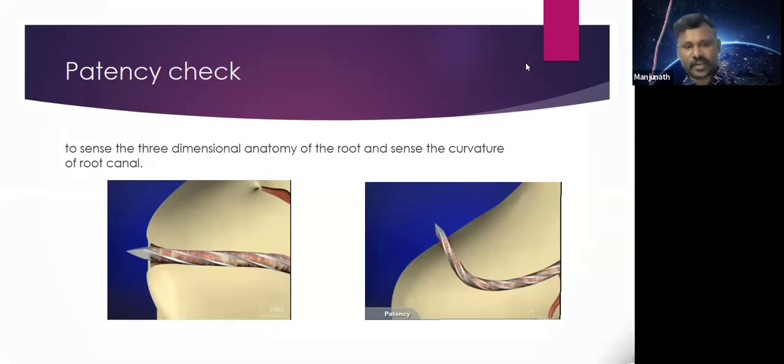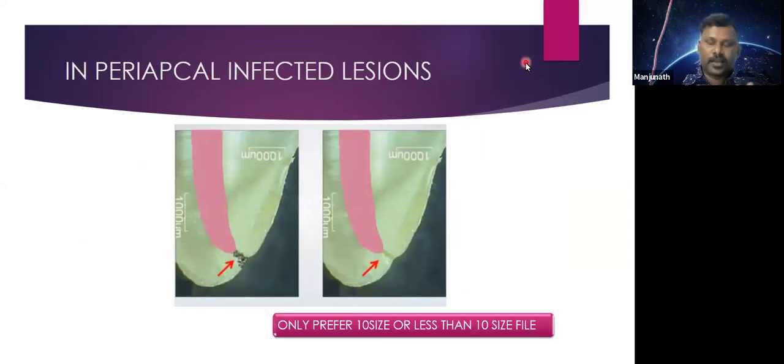Always use 10 size file. நீங்க வந்து பெரிய large files யூஸ் பண்ணக்கூடாது. It should be 10 or less than 10 size file. So main advantage vital teeth patency check பண்ணலாம். Periapical lesion cases தான் ரொம்ப important.